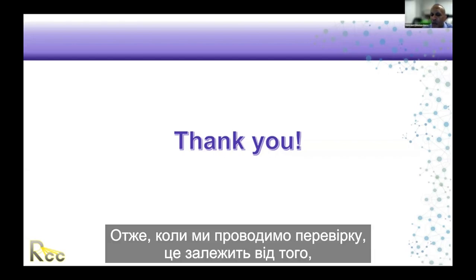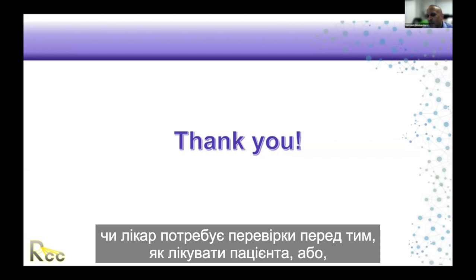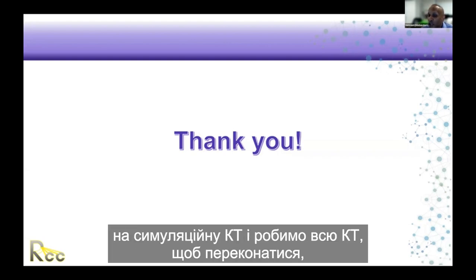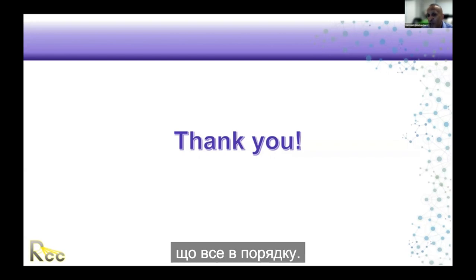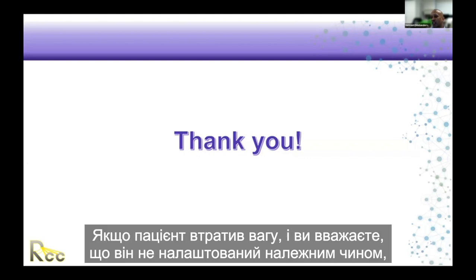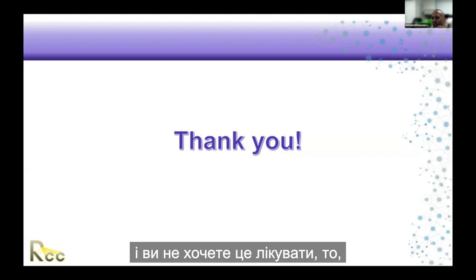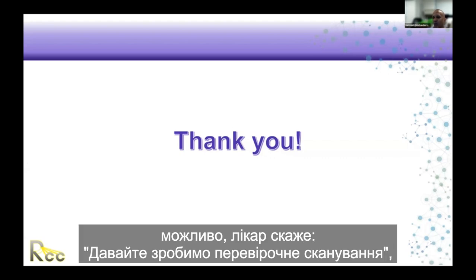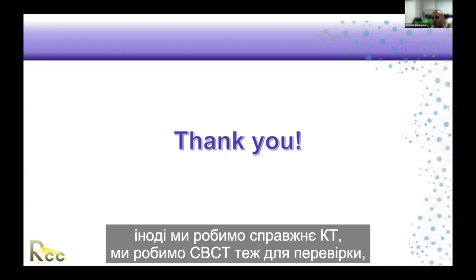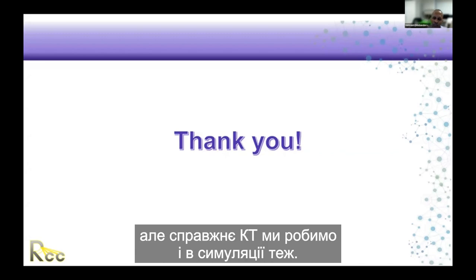Okay. So when we do verification, it depends. Sometimes the doctor needs verification before we treat the patient, and sometimes we even take them to simulation CT and do the whole CT to make sure that everything is right. So it depends on how the patient sets up. If your patient loses weight and you think that they don't set up well and the mask is too loose and you don't want to treat, probably the doctor may say, let's do a verification scan. That's an actual CT, not CBCT. We do CBCT too for verification, but there's actual CT that we do in simulation too.